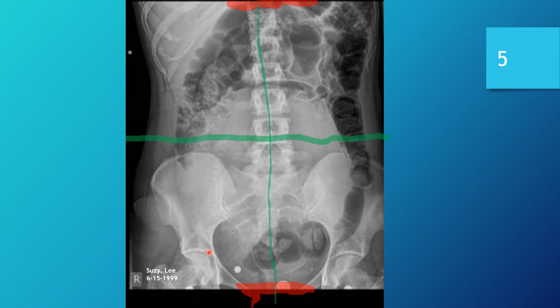Number 4, is the image free from artifacts? Actually, no, on both the external and internal aspects. Internally, we have this monumental amount of bowel gas and bowel stool, and it has just pretty much taken over the entire upper portion of the belly.